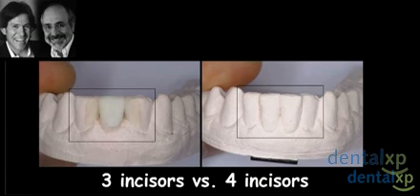And as a surgeon, for me, David, this is a real problem. And obviously we tried to speak to the patient about this, and the patient really said he wanted a solution that would give him this result rather than the result you see on the left. And how about that vulnerable area there between two implants? Well, this area right here I felt was something that I couldn't achieve trying to put in two implants. So we had to come up with another option.